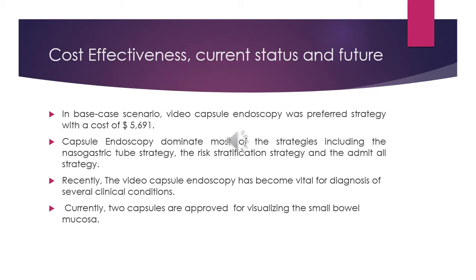Investigations in the future are ongoing to determine the utility of video capsule endoscopy in colon cancer screening, assessment of esophageal disorders, and diagnosis of celiac disease. Active research is also in progress in ways to improve the efficacy of video capsule endoscopy: recording interpretation, prolonged imaging time, and further enhanced optics and imaging methods.